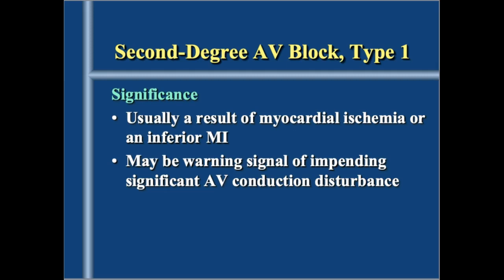This is usually something we watch closely because it can be a sign of an impending significant AV conduction disturbance, meaning that this could progress to a higher, a more dangerous type of block, which we're going to talk about.